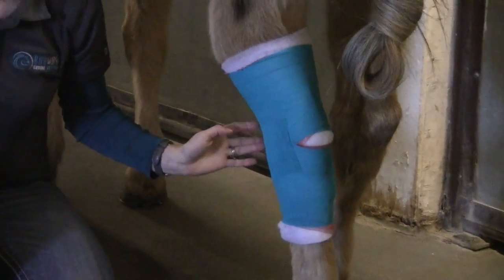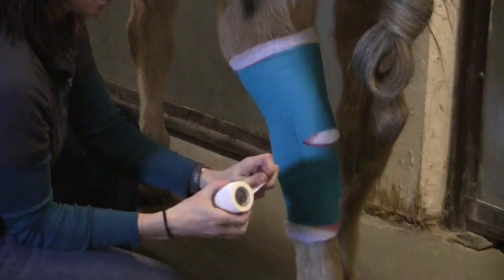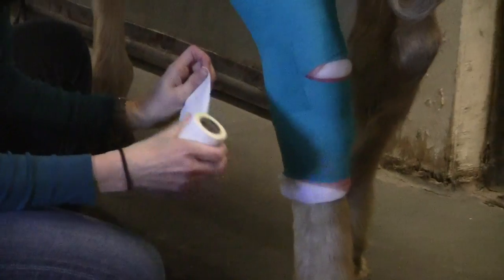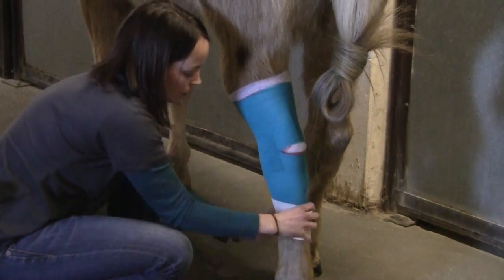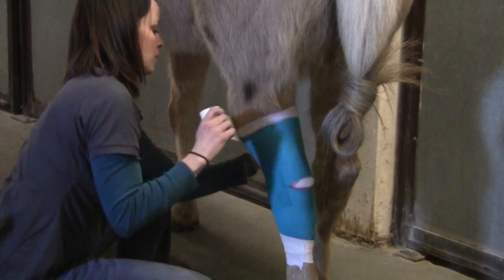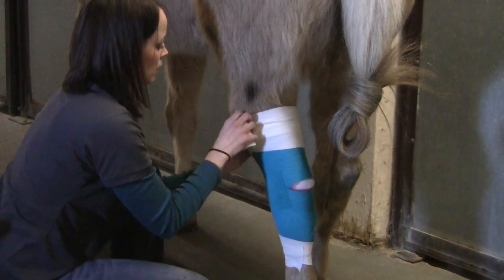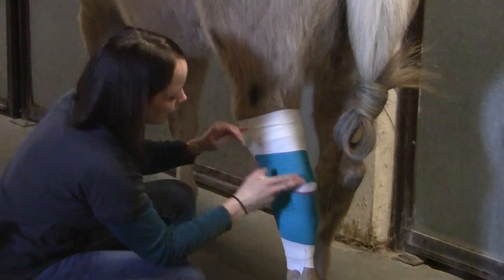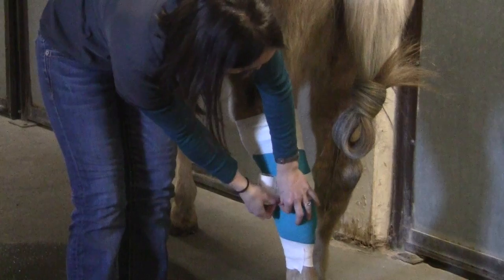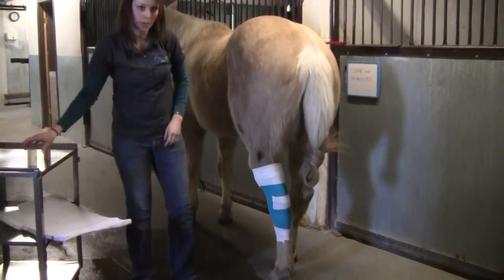To finish it off, one thing that will help it stick to the hair up top and down below is to apply light plast, which is really sticky on one side and not sticky on the other. I'll put that at the bottom, at the top, and then over the point of the hock that I've left exposed, just to seal it up. There you go — you have a bandage that hopefully will stay in place and keep that wound protected.